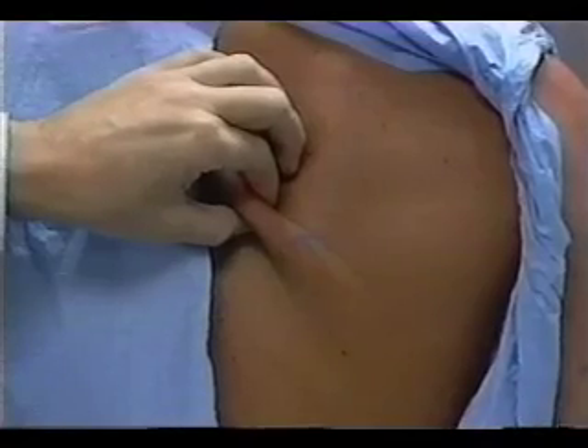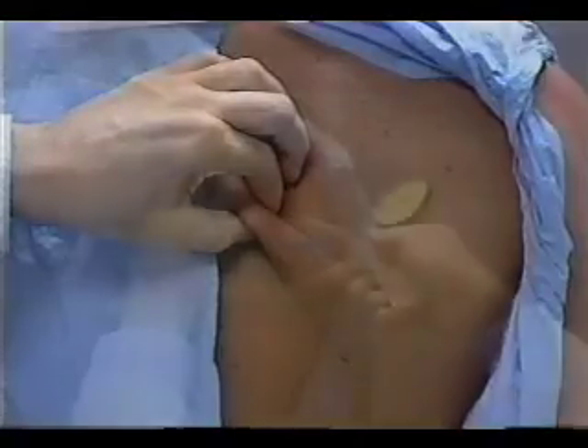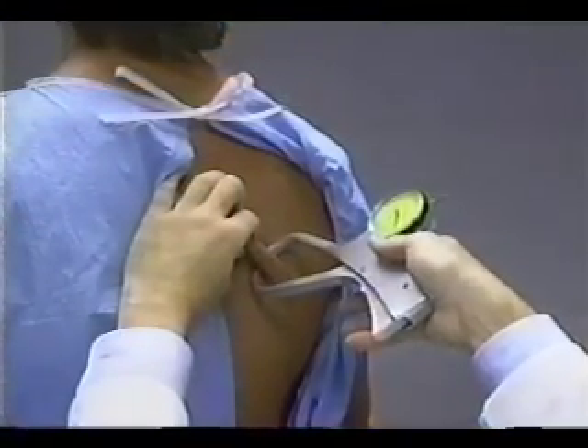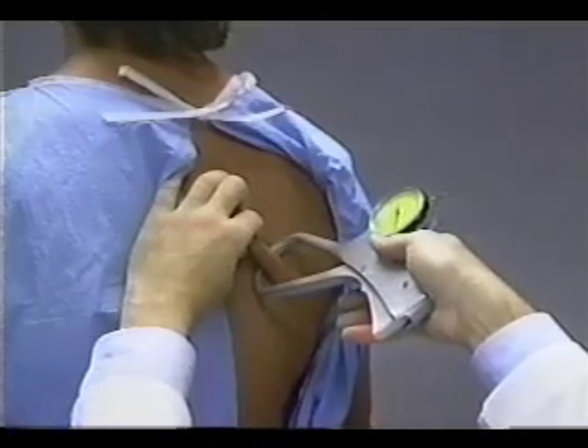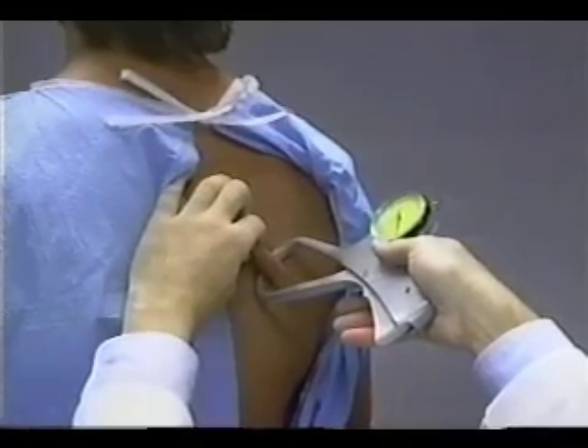The skin fold forms a line extending diagonally toward the right elbow. The jaws of the caliper are placed perpendicular to the length of the fold, two centimeters from the fingertips, with the tip of the top caliper jaw directly on the mark at the inferior angle of the scapula.